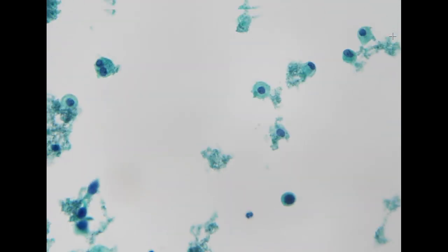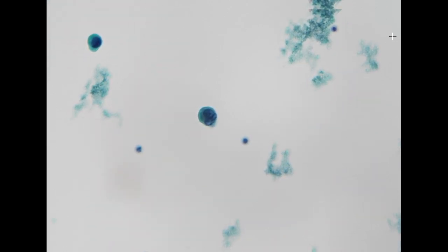But the patient does have an elevated PSA level, so it's still likely to be a prostatic cancer. We will send these out as positive for metastatic adenocarcinoma, and the biopsy can be checked for immunohistochemistry.